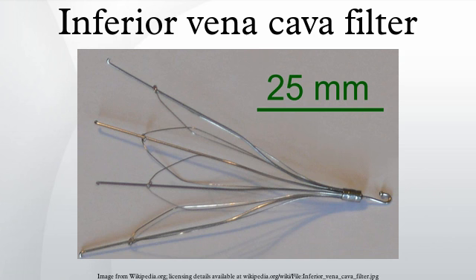Over a period of about 5 years, they identified 921 events. While not the majority of cases, that number still represents a statistical significance of the use of long-term IVCs. Of these IVC filter side effects, 328 involved device migration, 146 involved embolizations after detachment of device components, 70 involved perforation of the IVC, and 56 involved filter fracture. Much of the medical community believes that this large number of adverse events is related to the filter remaining in place for longer than necessary.